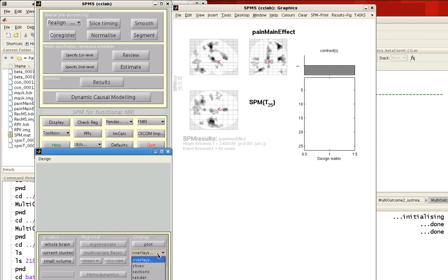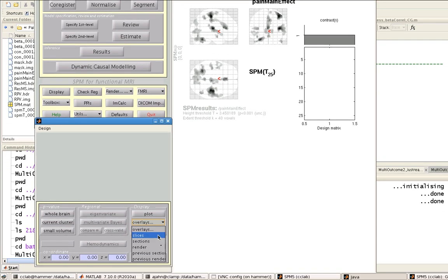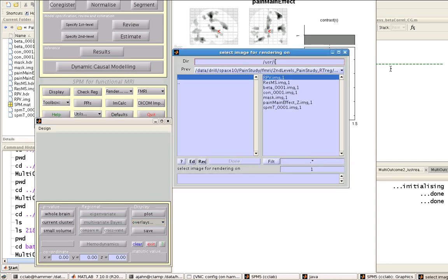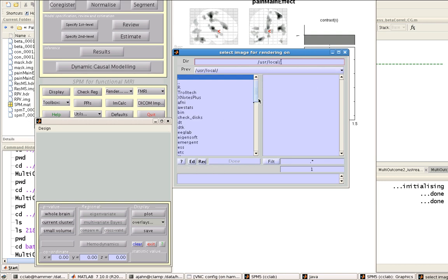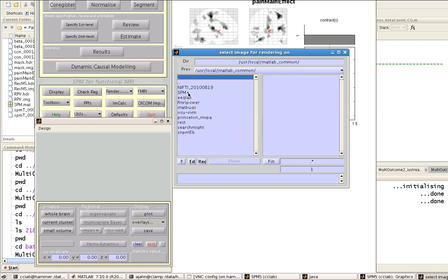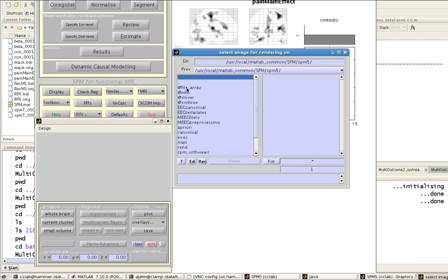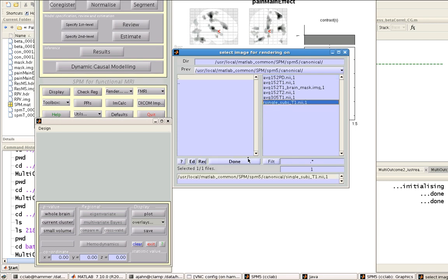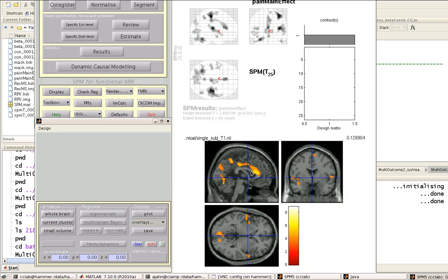Now if I click on overlays and I go to sections, I go to my directory containing my SPM library. This may be different for you, but here's where we installed ours. So in a folder, either SPM5 or SPM8, you'll see another folder called Canonical. Click on that, and then you can use any of these templates to view your results on.